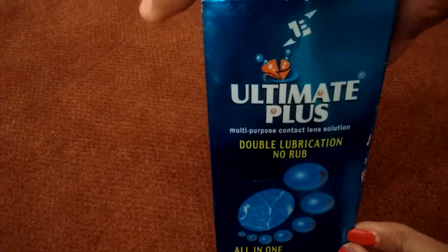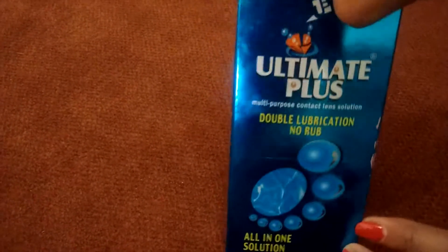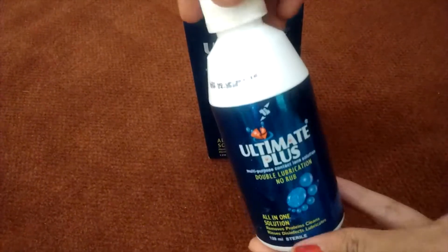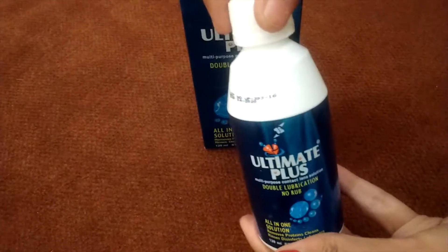Let me open this box and show you the packaging. This is how it looks — it comes in a bottle and it is very handy to use.